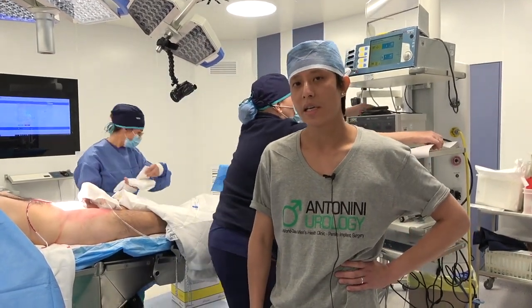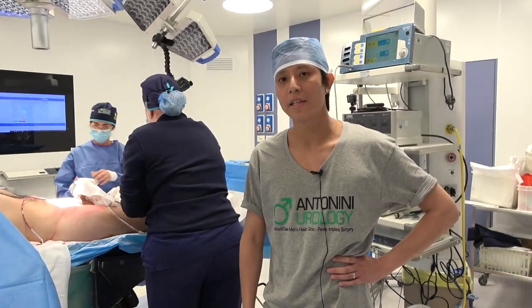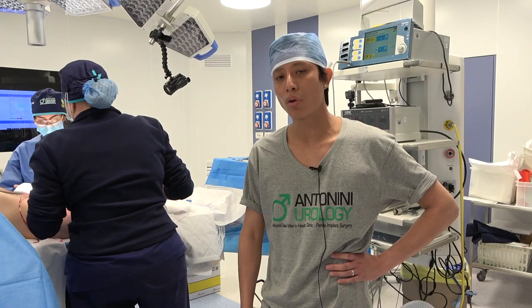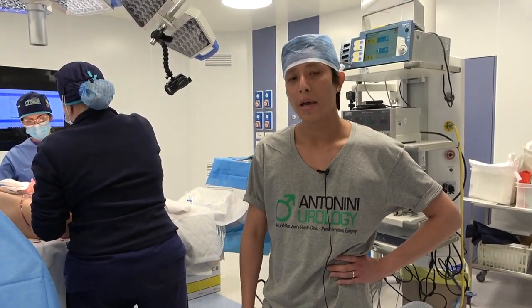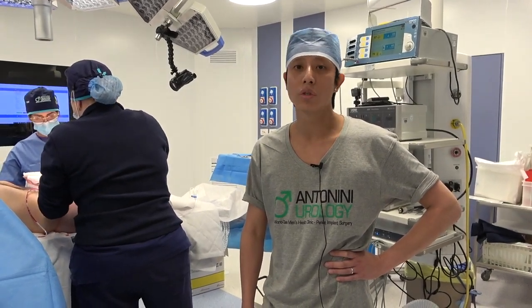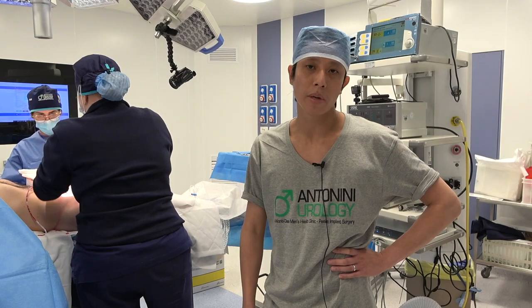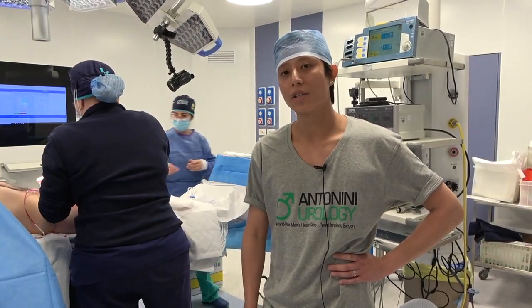This approach is very slick — he's neat, slick, and fast. It provides an alternative approach to inserting a penile prosthesis for patients. I'm more experienced with the penoscrotal approach. I've seen videos and read papers about this approach, but this is my first time watching it live, and it was very fascinating to watch.